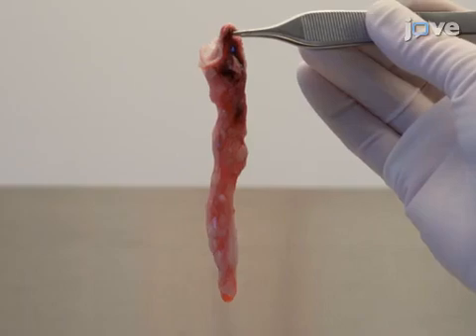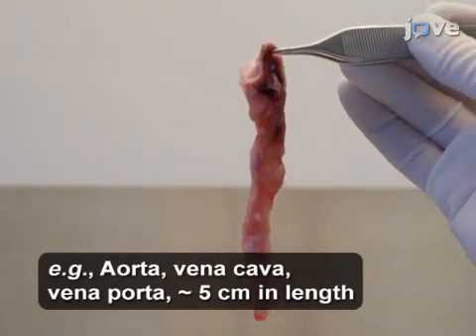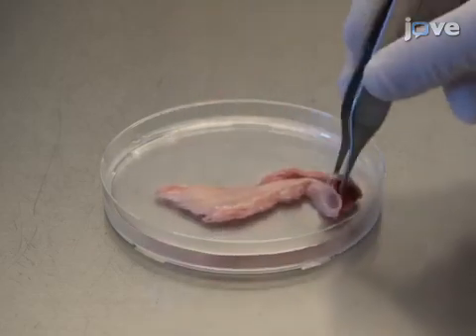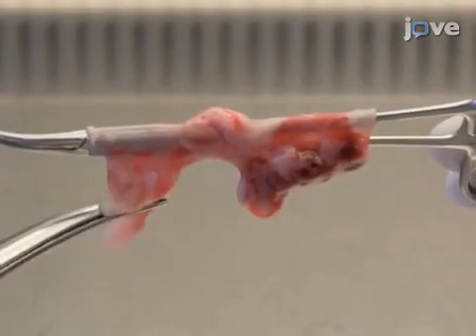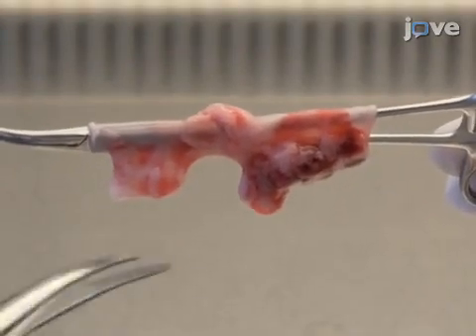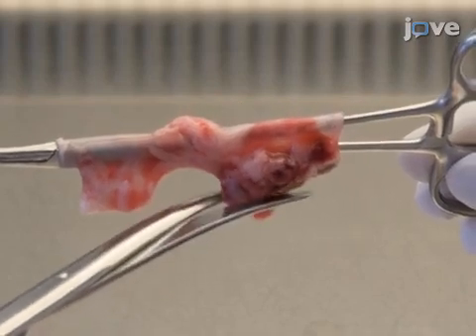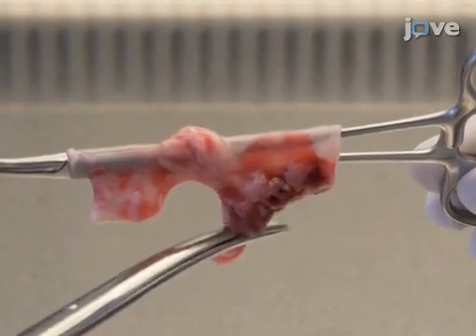After aseptically removing blood vessels of interest from a canine cadaver according to the text protocol, transfer the blood vessels to petri dishes filled with ice-cold HBSS. Then, using surgical scissors, remove any adherent tissue and fat from the outside of the vessel, making sure the vessel itself is visible at all times when cutting and keeping the vessel itself intact.